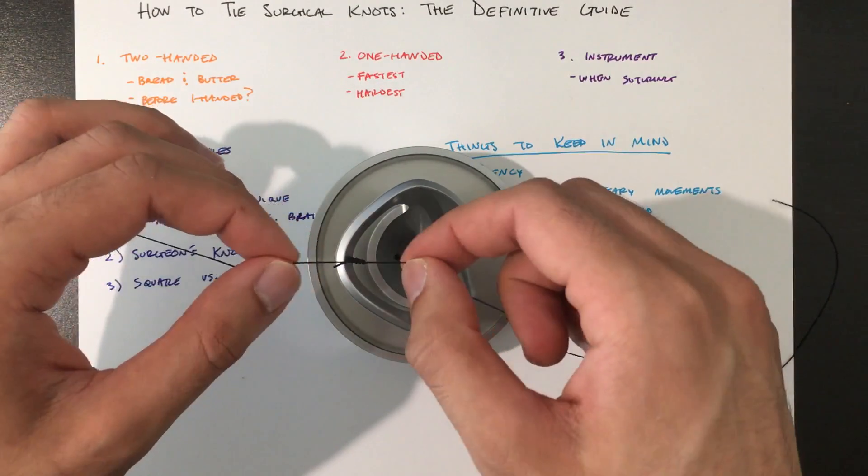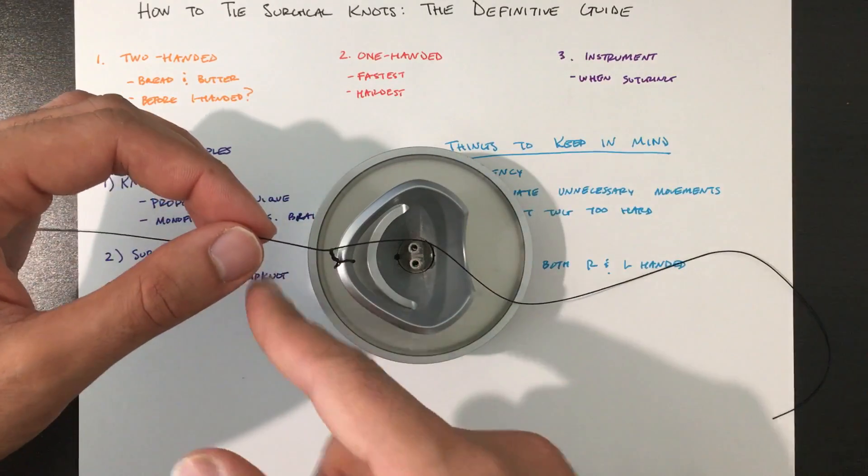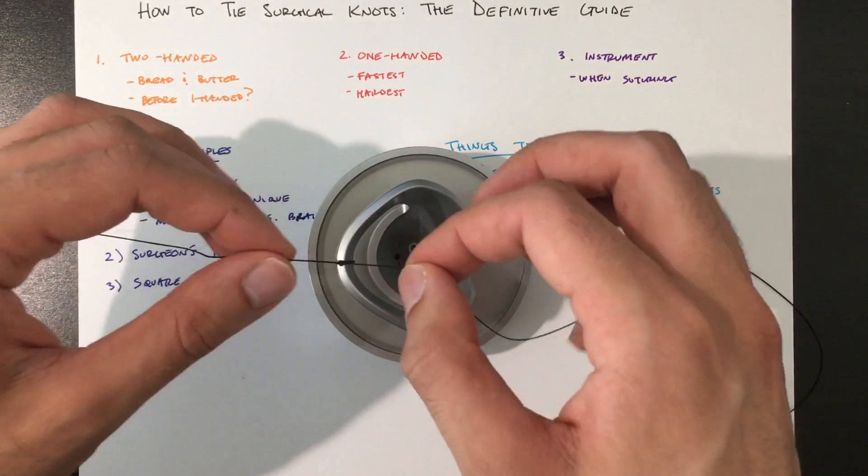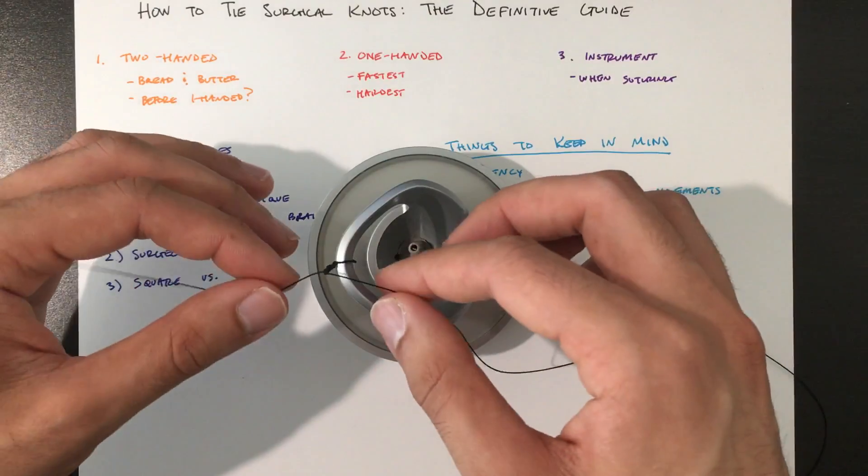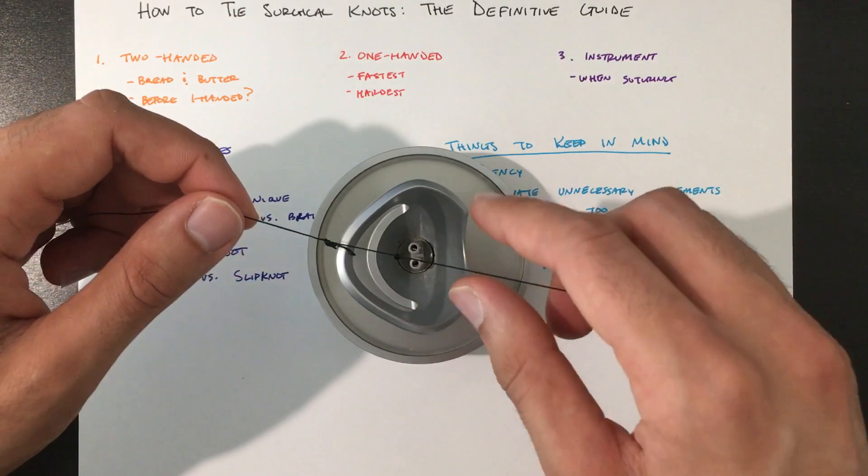So again, what I would do if this was a fresh suture I ran out, I would have these criss-crossed, just like I did for the two-handed. And there's two movements for the one-handed: there's the book and the gun. So we'll start off with the book.